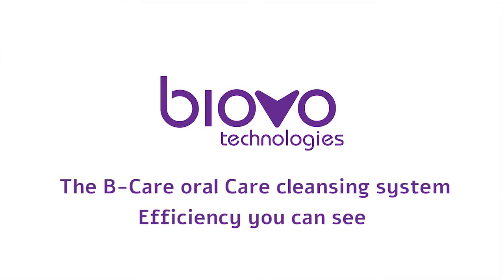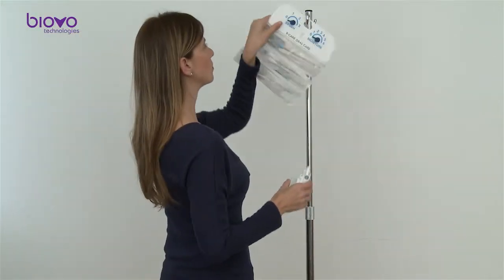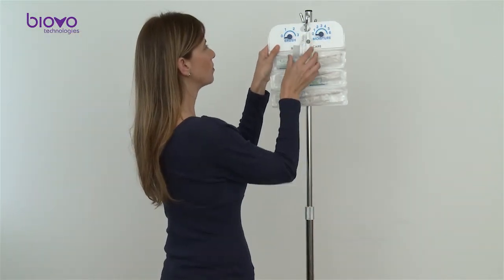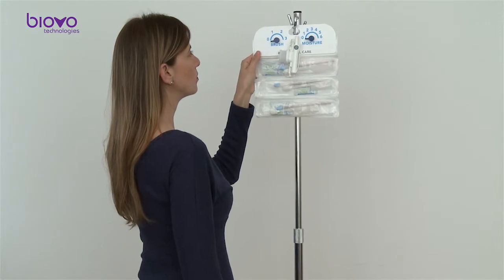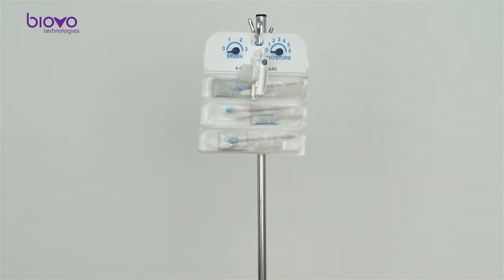The BeeCare Oral Care Cleansing System is designed to provide 24 hours of comprehensive oral care for ventilated patients. The BeeCare kit can be flexibly and economically adapted to any hospital protocol.